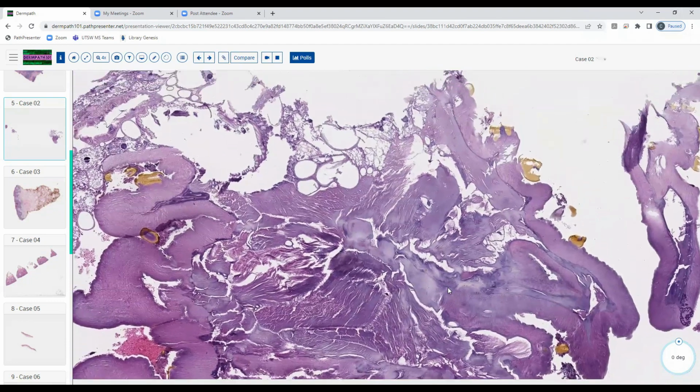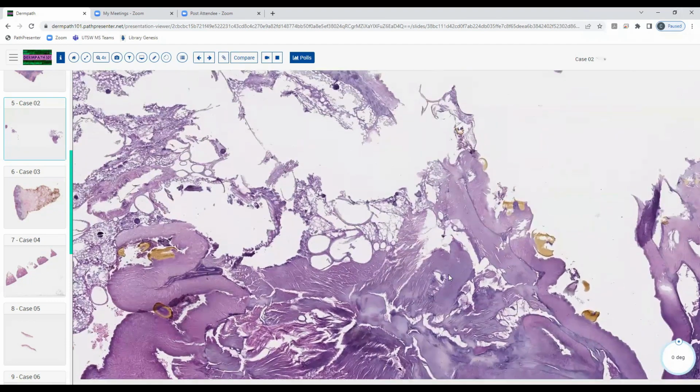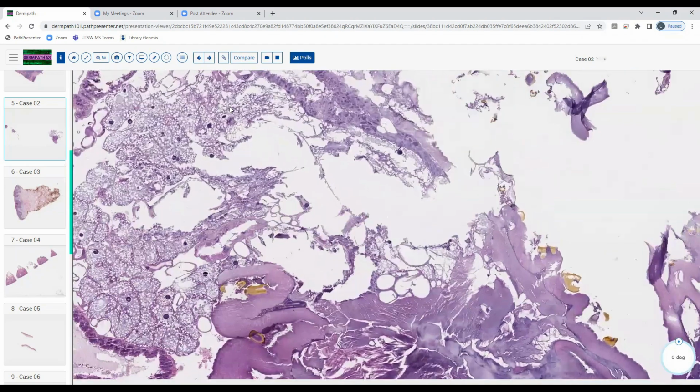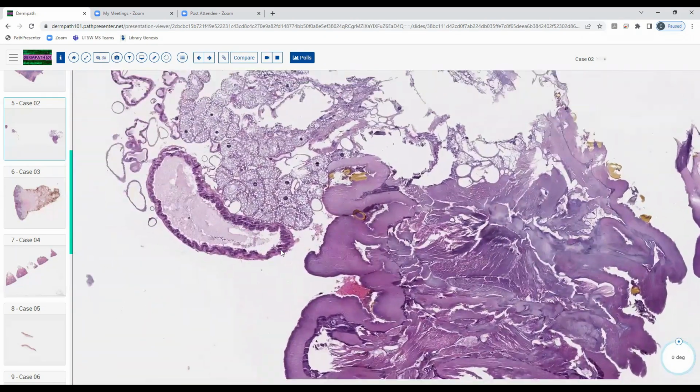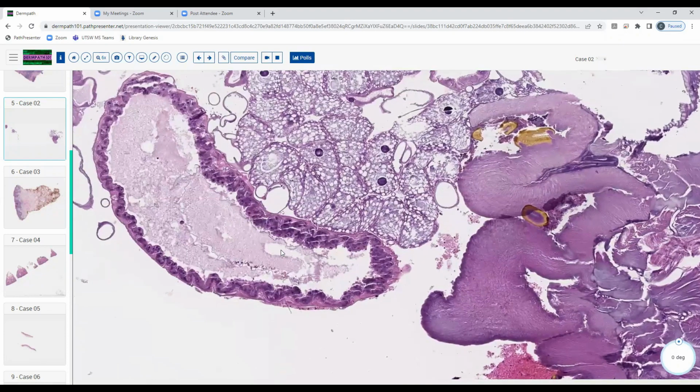Yeah, just with the jagged borders, I was thinking it could be an arthropod. It has these strange, jagged, kind of rigid lines that we don't really see in human tissue. Good. Excellent. That's exactly right. So yes, this is an arthropod.